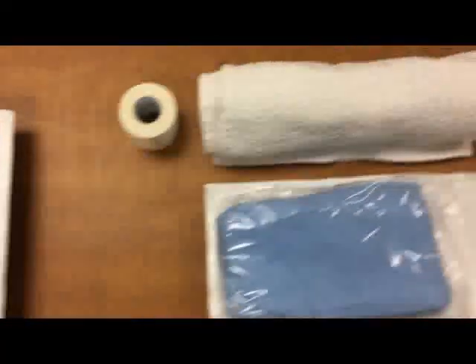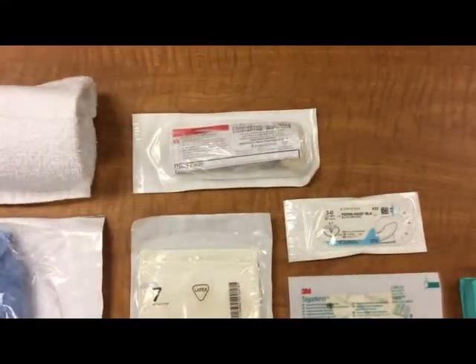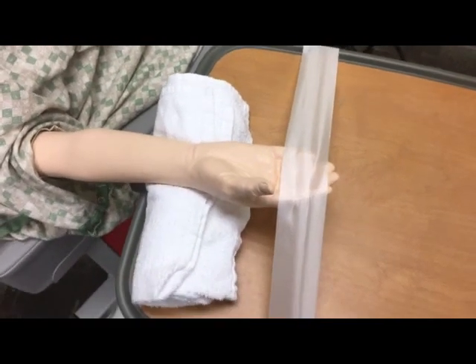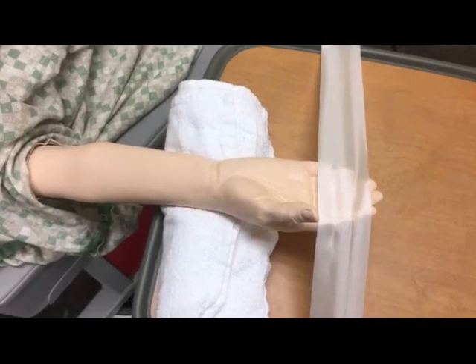Other supplies you will need are tape, towel, sterile towels, chloroprep, gloves, sutures — this is 3-0 silk — a dressing, and an armboard. A typical setup for the radial artery is to place a rolled towel under the wrist and tape the hand down for ease of access to the radial artery.